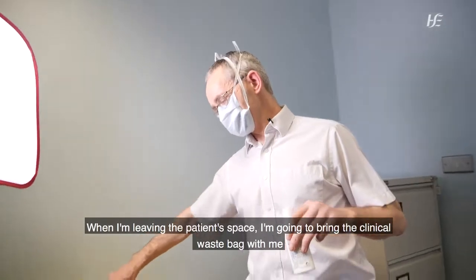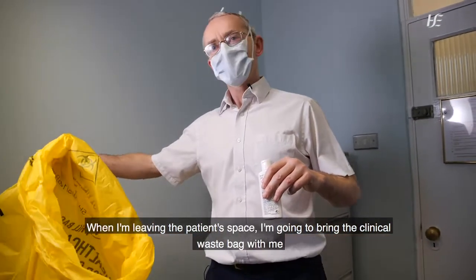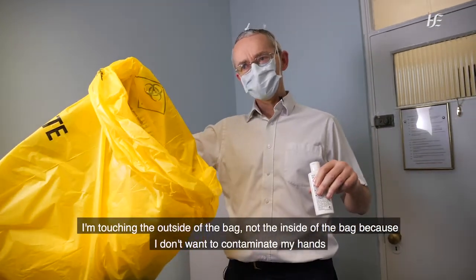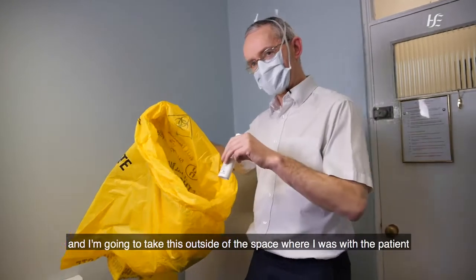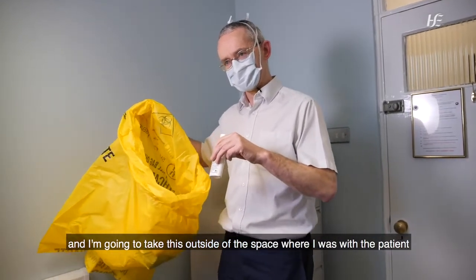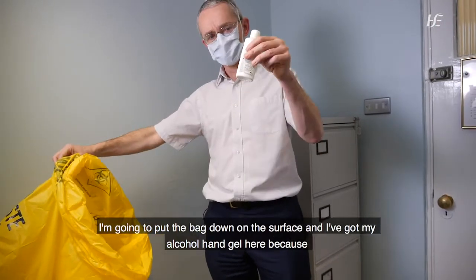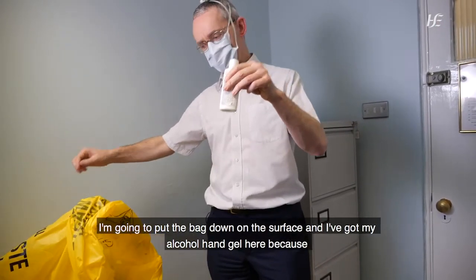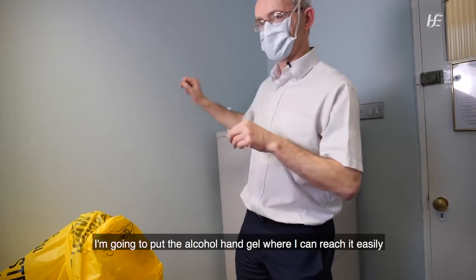When I'm leaving the patient's space, I'm going to bring the clinical waste bag with me, touching the outside of the bag, not the inside of the bag, because I don't want to contaminate my hands. And I'm going to take this outside of the space where I was with the patient. And I'm going to put the bag down on the surface, and I've got my alcohol hand gel here because I'm going to need that also. And I'm going to put the alcohol hand gel where I can reach it easily.